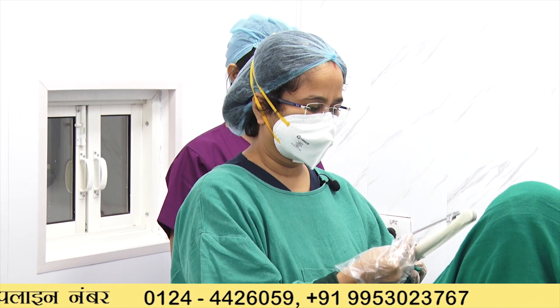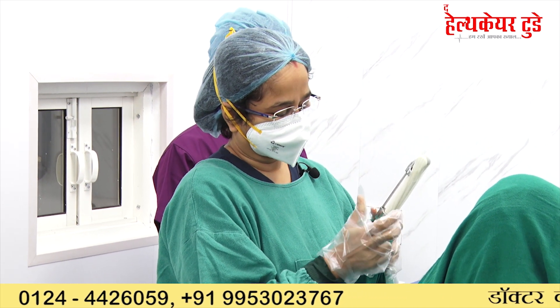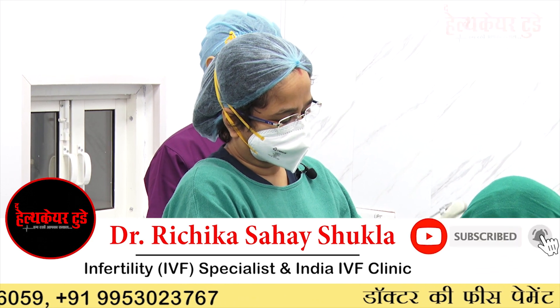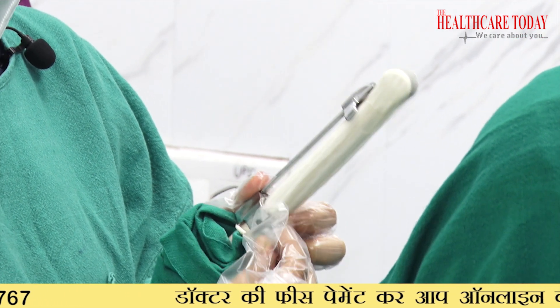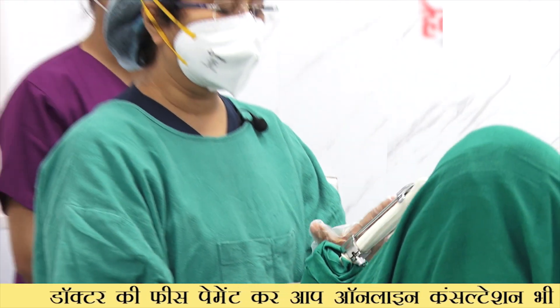After covering the probe, a biopsy guide needle is applied to the transvaginal probe. Now your probe is ready for the ovum pickup.